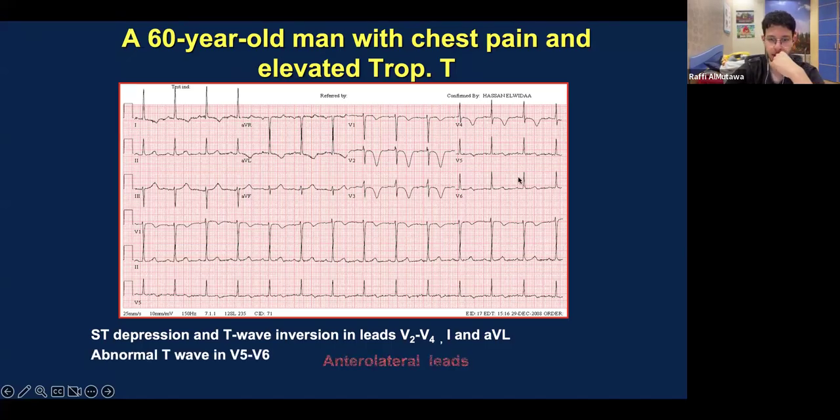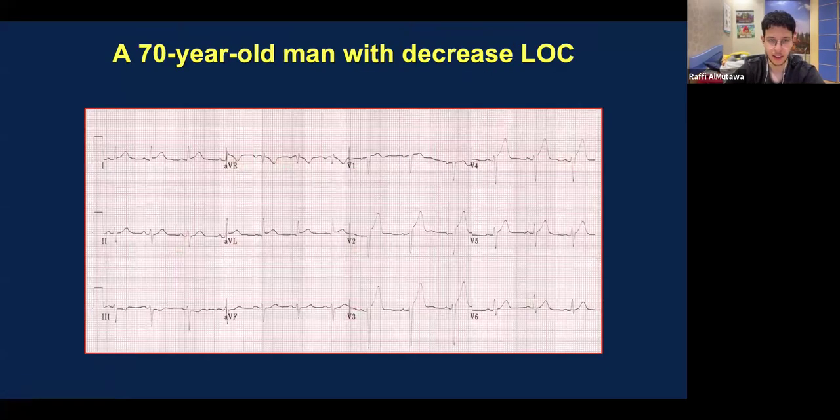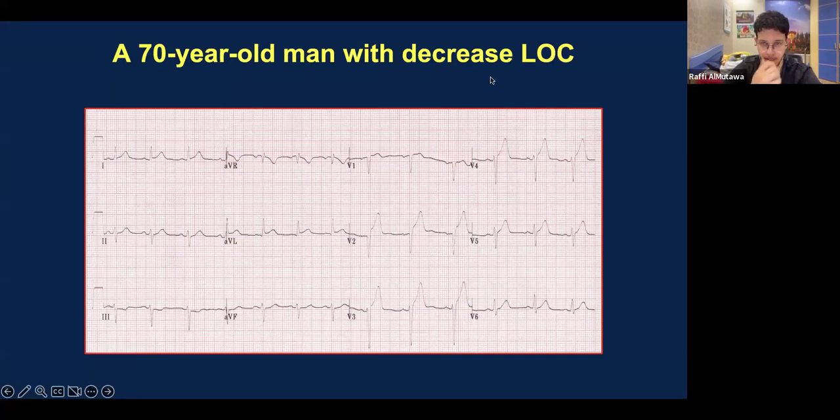So yeah, good job, guys. You're doing amazing. Okay, what about this one over here? And decreased LOC means decreased level of consciousness, by the way.